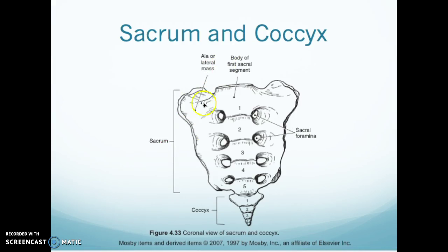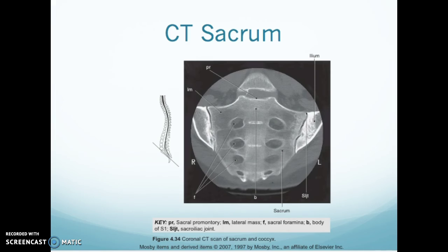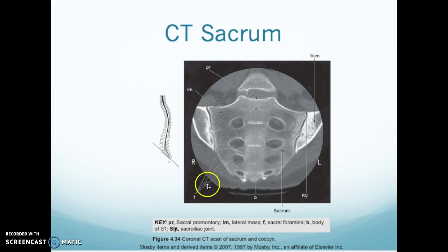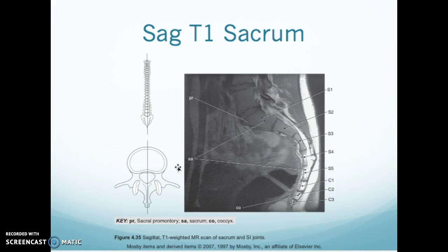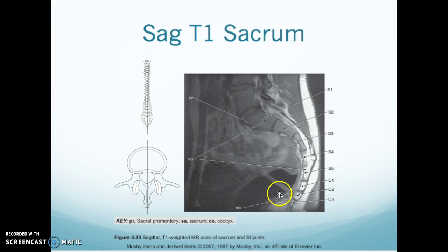The sacrum and coccyx: you have your ala or lateral mass, your first segment, your foramina — and you count 1, 2, 3, 4, and 5 — then between 3 and 5 bones in the coccyx. On CT of the sacrum you have your sacral promontory, your ilium, your sacroiliac joint, and your sacral foramina. On MRI T1 sagittal of the sacrum, here is S1, 2, 3, 4, and 5, and this person has 3 coccygeal bones visible.